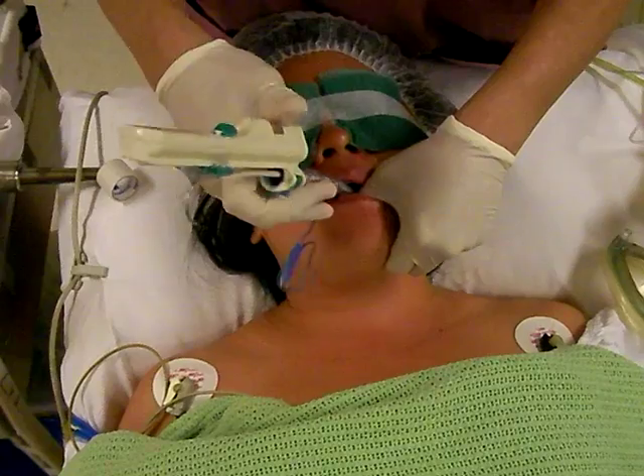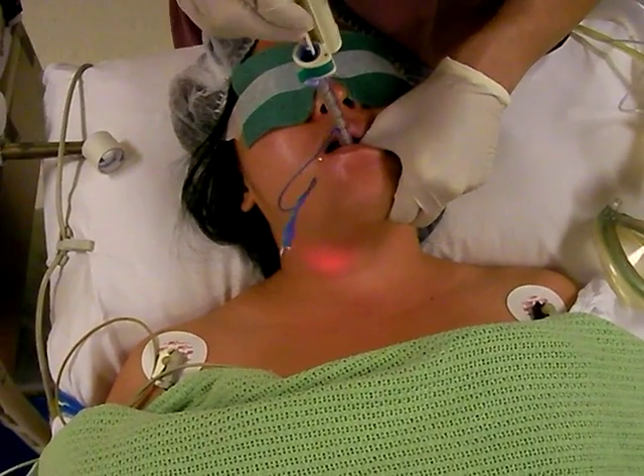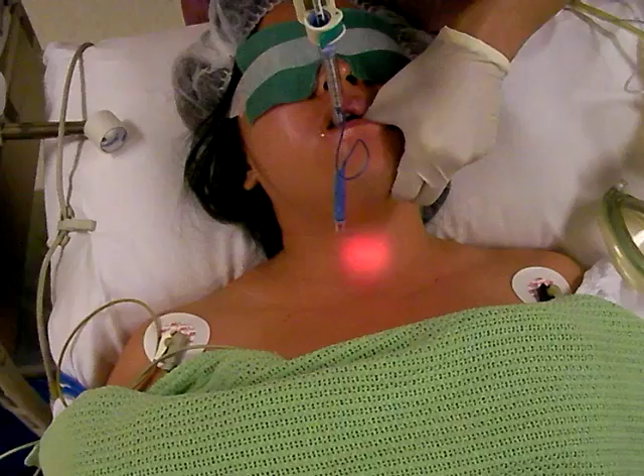When the tip is pointing anteriorly, you switch on the traclight and look for the glow. You try to put the glow at the center. If you can put the glow at the center, then you can advance the traclight.